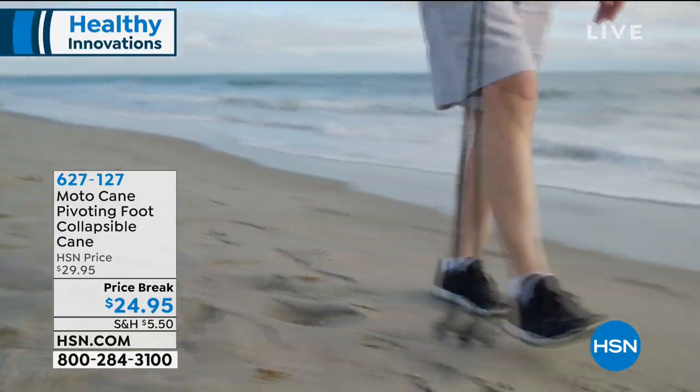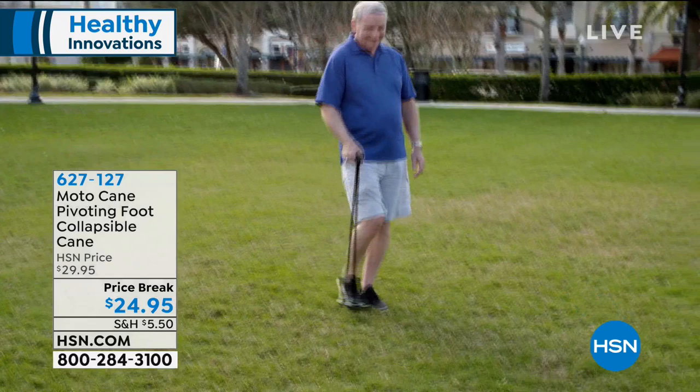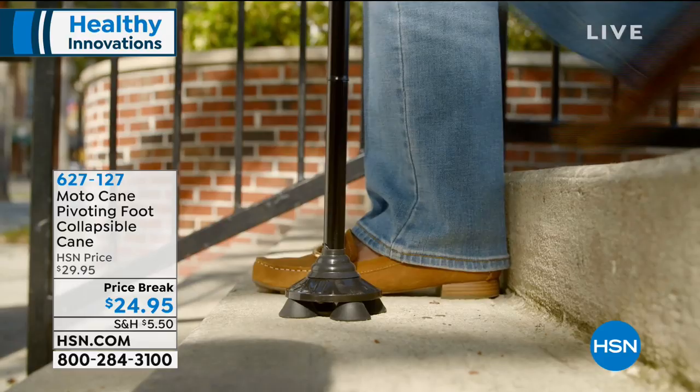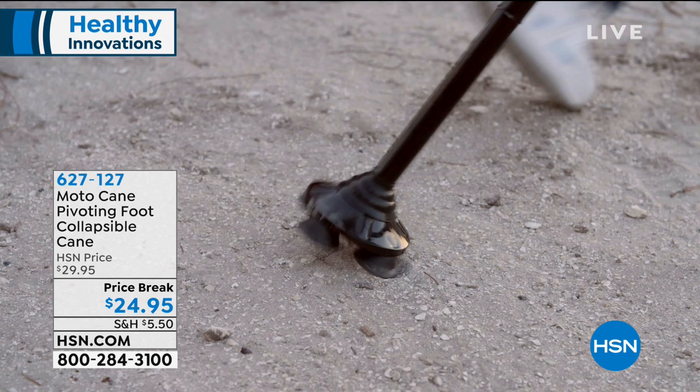I can find canes everywhere — there are canes everywhere — but they're not all built to the needs that we have when we use or need a cane. This is a pivoting foot cane. It's collapsible, so it doesn't have to stay up all the time. It pivots with you, and it can also be converted so you can easily walk when you're out and about, or when you're getting in and out of a car.